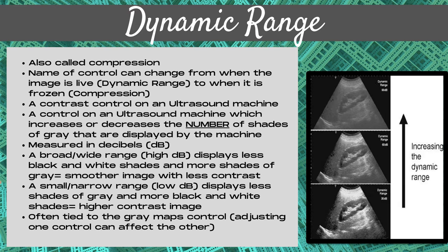This ultrasound control increases or decreases the number of shades of gray that are displayed by the machine, and this is measured in decibels. A broad or wide range — a high dynamic range level — displays less black and white shades on the ultrasound image and more shades of gray. This gives you a smoother image overall with less contrast. A small or narrow range — a low dynamic range number — displays less shades of gray and more black and white shades. This gives you a higher contrast image.